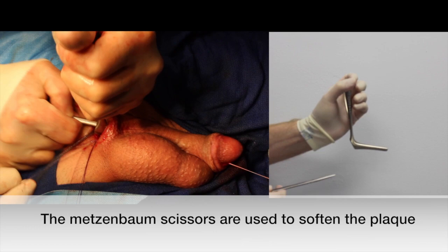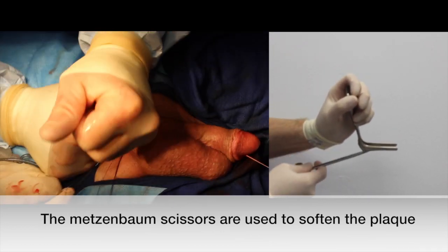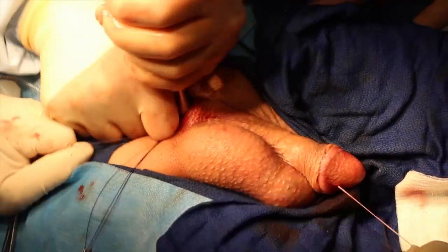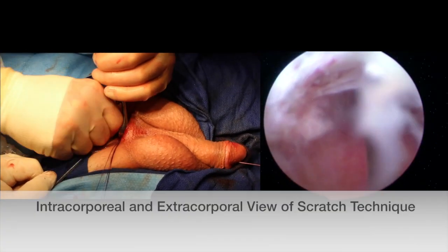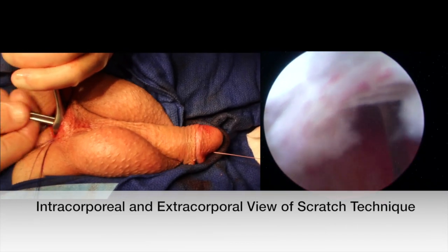Here we can see an extracorporeal view of what the authors are performing intracorporeally. One can also appreciate the sound. On the right, one can see an intracorporeal view of the hook blade incising the white fibrous plaque, while on the outside we have an extracorporeal view of the author's motions.